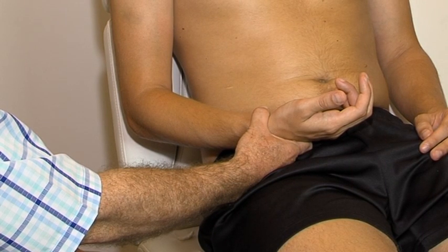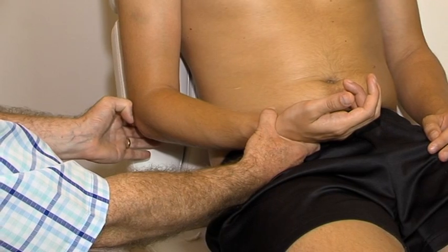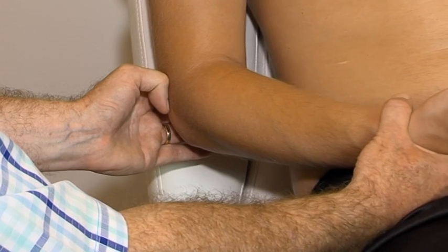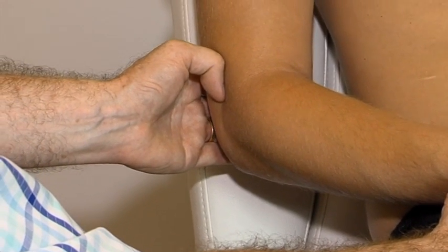The starting position is 90 degrees flexion and supination. The therapist's thumb is 90 degrees flexed, with the tip of the thumb lateral to the lateral epicondyle. The insertion lies at the front of the epicondyle, so he brings his thumb onto the anterior aspect of the bone.